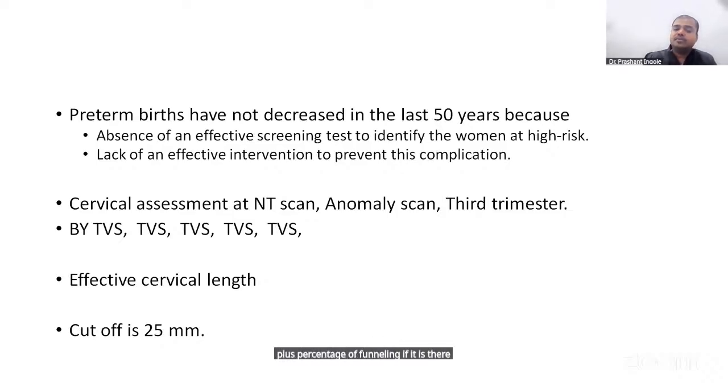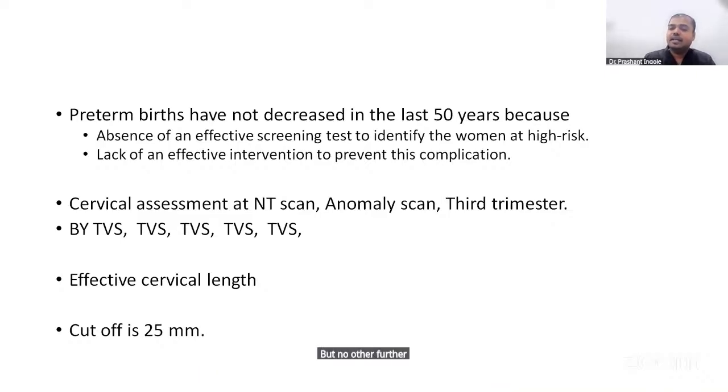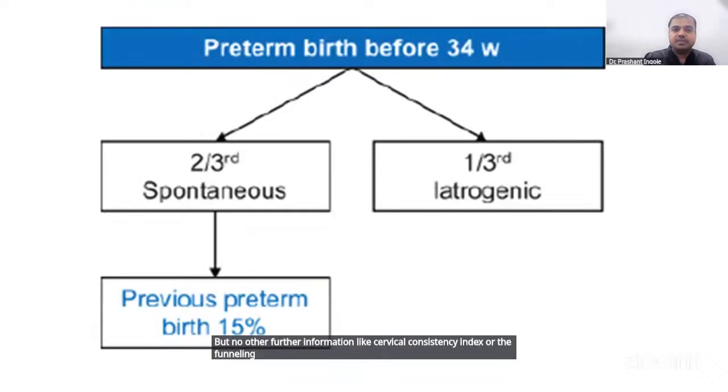And the cutoff is 25 only. We see many reports where the cervical length is 30 and it is written as short cervix, but no further information like cervical consistency index or the funneling has been mentioned.